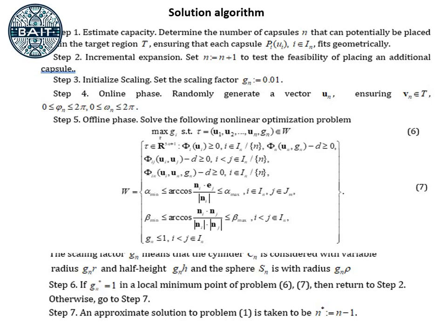The main goal is to quickly verify the possibility of placing new capsules under these conditions. After initial placements, all capsules are gradually restored to their full sizes. The dual-phase approach allows for adaptive and efficient capsule placement in complex anatomical regions, balancing speed and clinical accuracy.